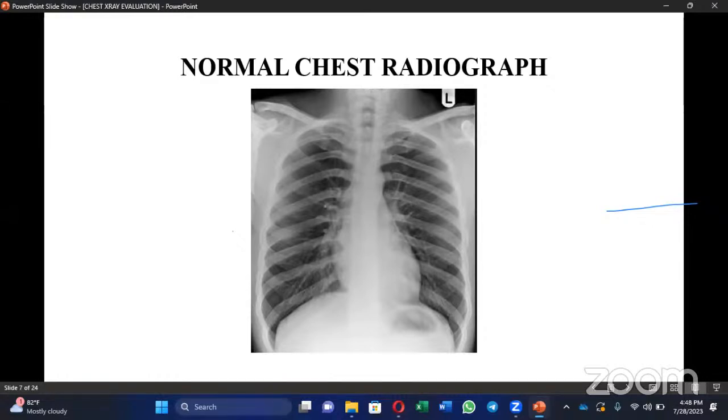How do we see when there is a fracture within the bone? When you are tracing the cortices of the bone, and you get to a point where there's discontinuity along the way, you pause and you know that that part is fractured, or there's a fracture within that area. Hope you get me. So you trace the bone, you trace the cortex.